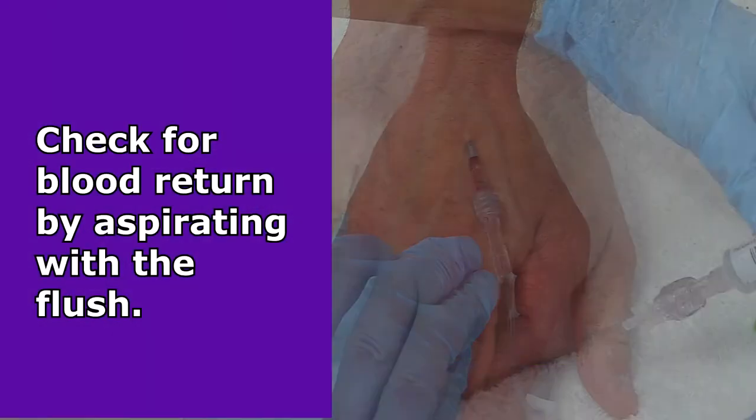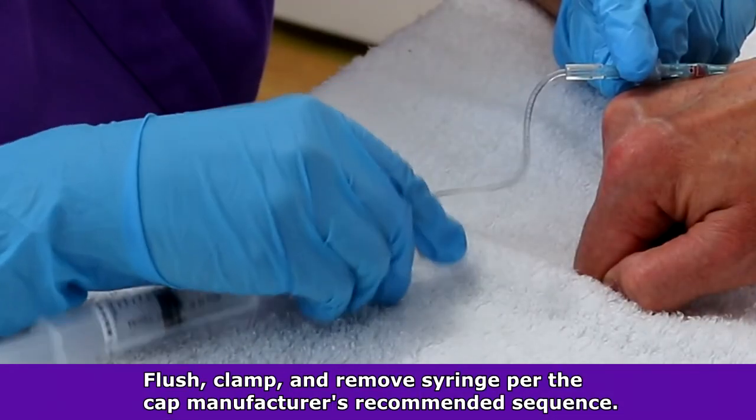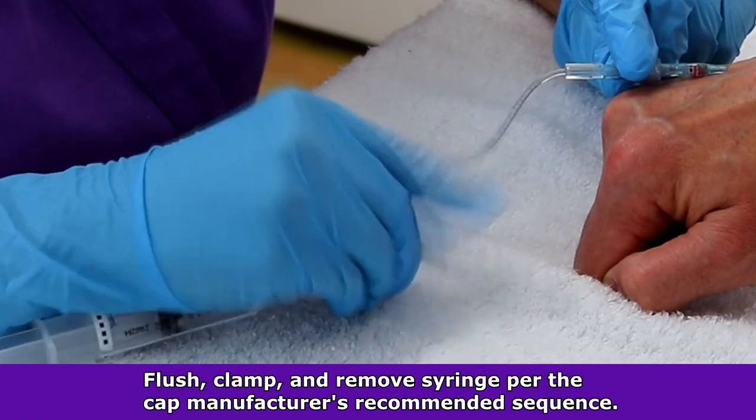Once you have inserted the IV, aspirated for blood return, flushed, and clamped it off per your facility's protocol, you'll want to secure the IV in place.